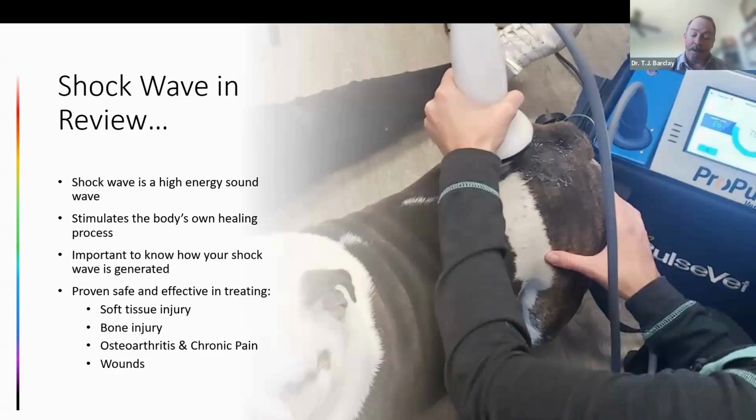Based on the differences in waveforms and focal zones and so forth, it is important to know how the shockwaves were generated in any particular research. Because of those differences, you can't necessarily extrapolate the results from work done with one device and say that it's going to work the same when performed with another device.